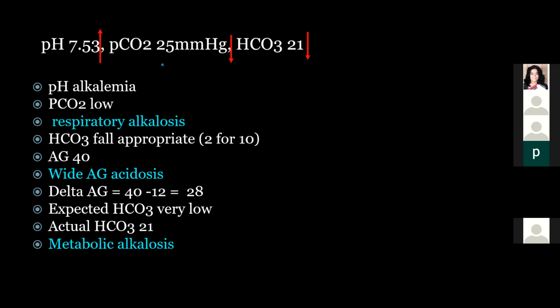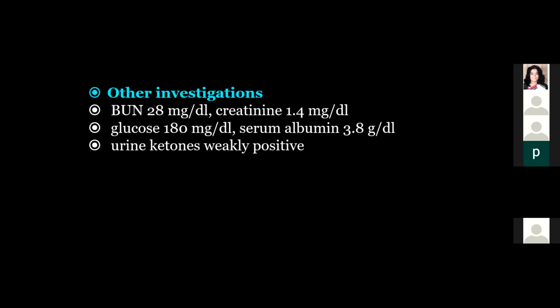But when you yourself analyze, you find it's not such a straightforward, simple respiratory alkalosis. There's a huge anion gap acidosis. So once you have that, no matter what your pH and bicarb look like, this is a severe, very severe acidosis. So what was the lactate? I do not have a lactate value, but that is an important question. We need to know how much was the lactate which this child had.